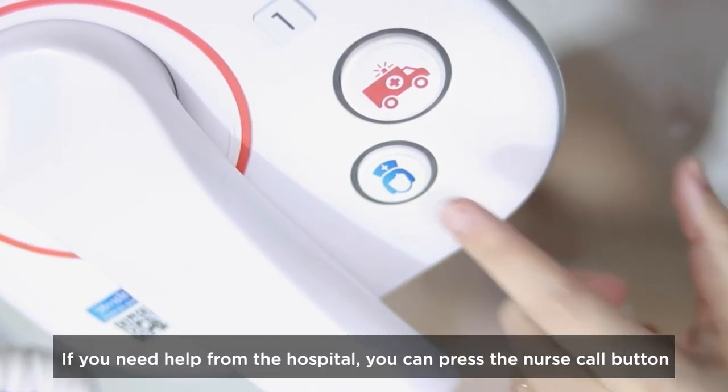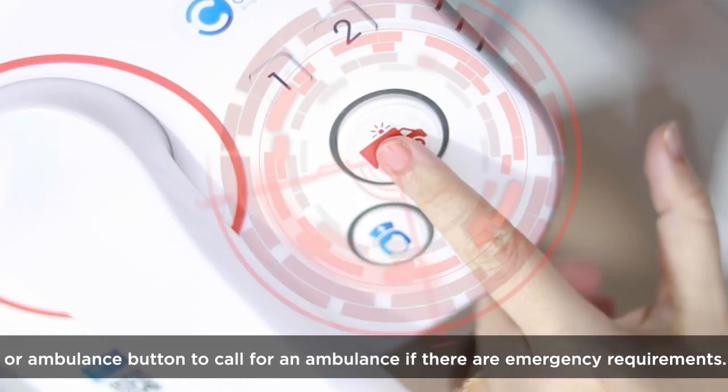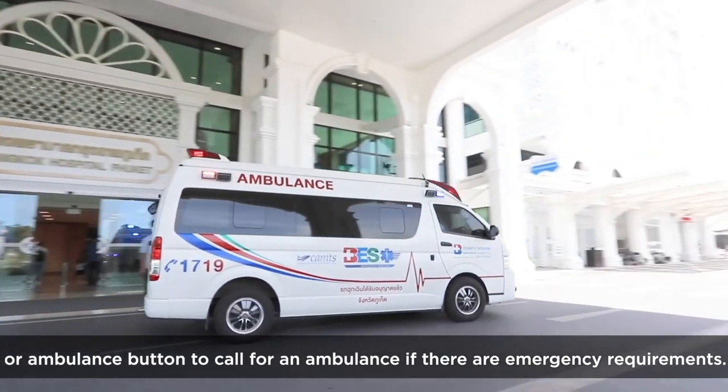If you need help from the hospital, you can press the nurse call button or the ambulance button to call for an ambulance if there are emergency requirements.